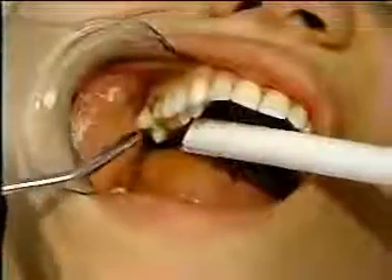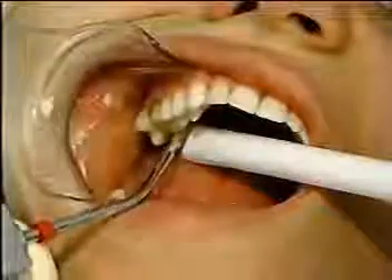The cord is removed and once again the area is cleaned and tested for completeness of hemostasis with a firm air-water spray before the impression material is mixed. If any bleeding occurs, the dental infuser is used again to seal off the problem area.